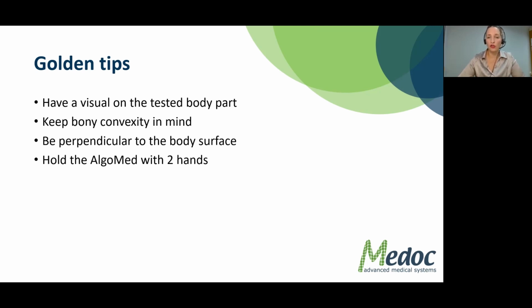Another thing that I want you to keep in mind is bony convexity. The bones sometimes have flat surfaces, sometimes round surfaces, and if you start applying pressure on the round surface, you may slip off of it. As soon as you slip, this is very, very painful. This is very sharp pain that will stick around for a while. So keep in mind when you're choosing the body site that this is a site where you can apply pressure without slipping off of it.